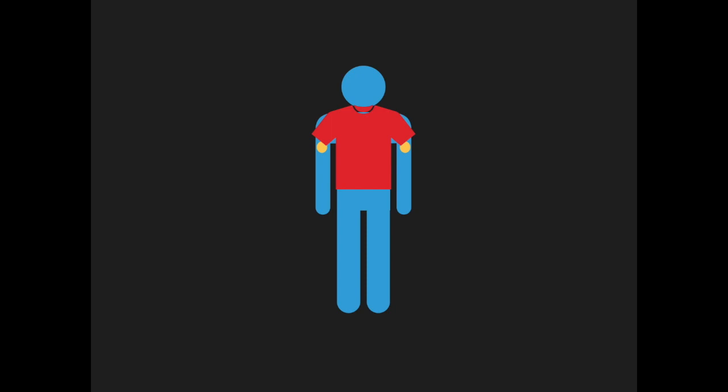Do not shove the leads down through the shirt to get them on the chest. They should go on the limbs, but you can place them proximal. So if the patient has a t-shirt on, this is very easy because you can just pull up the sleeve a little bit and still have room for your blood pressure cuff below that.